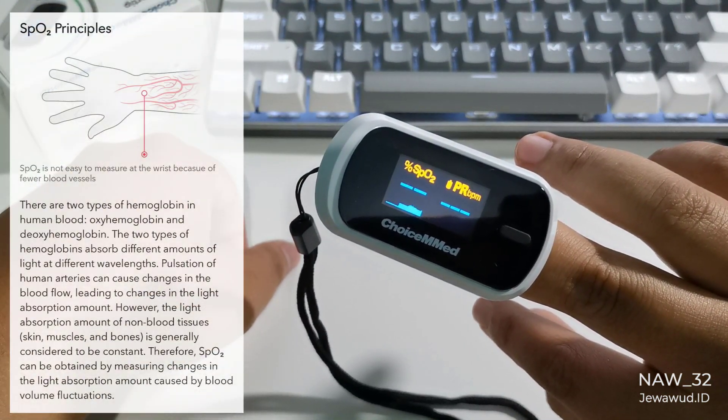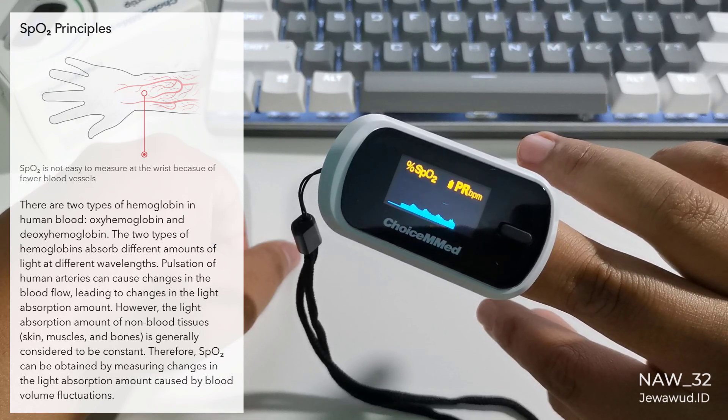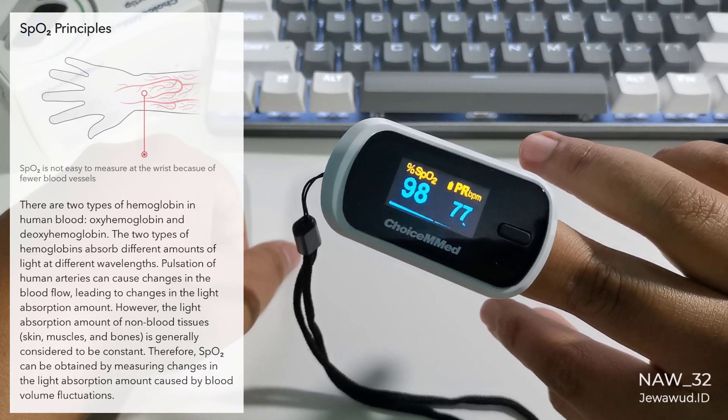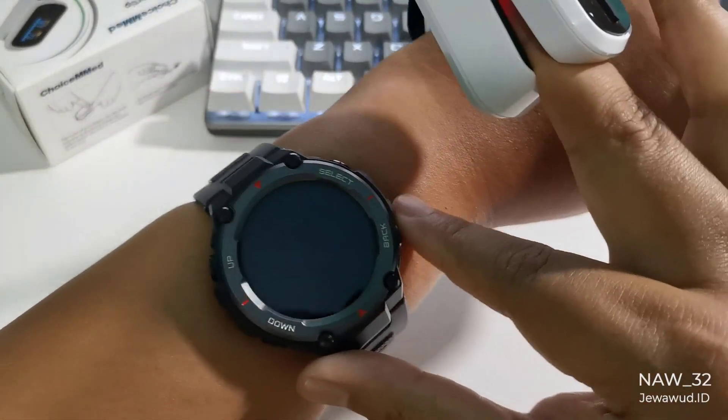Did you know, it's very hard to measure SpO2 at the wrist using a smartwatch or smartband. You have to wear the smartwatch one finger away. You have to wear it very tight. No movement whatsoever while measuring.